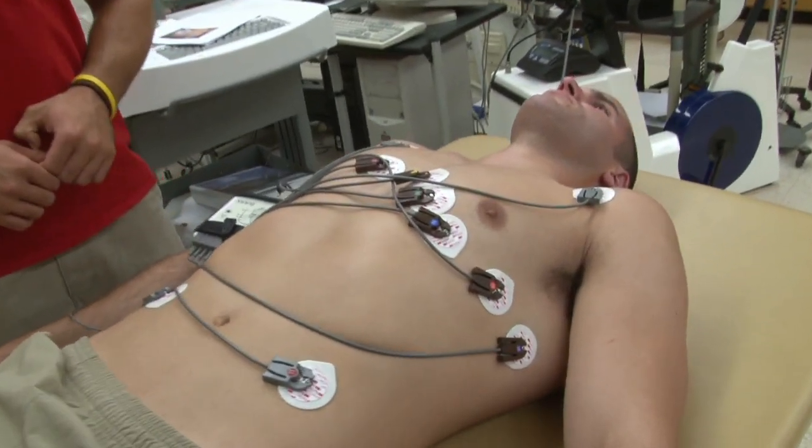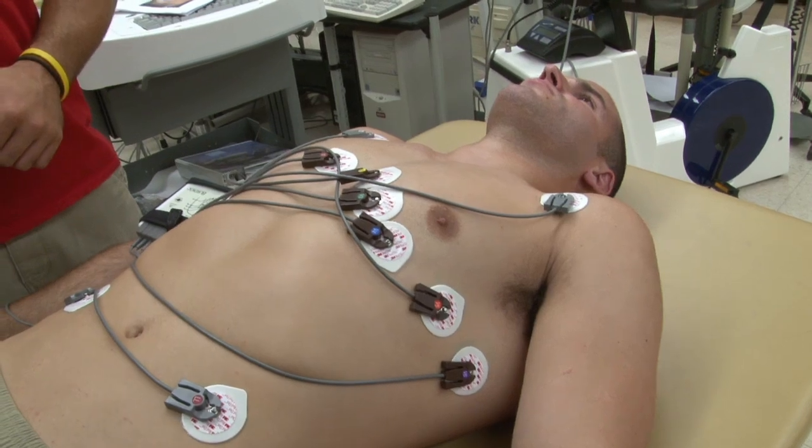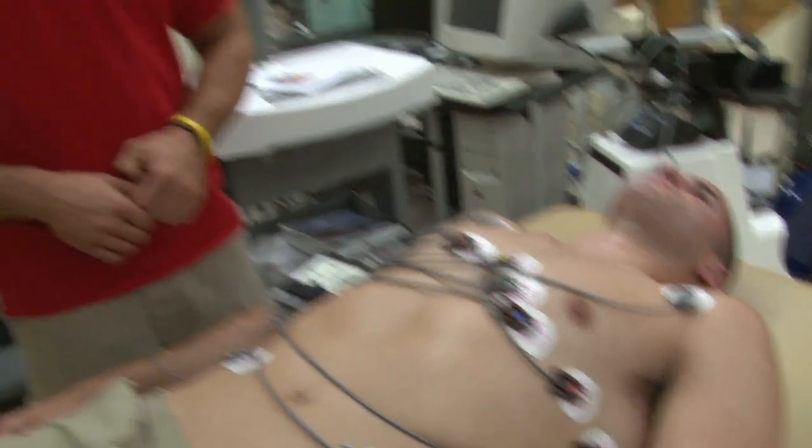Then you just inform the patient to remain relaxed during their entire test. You don't want them to move a lot during the resting test. Obviously during the exercise test they will be moving.